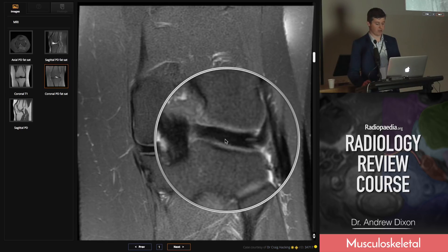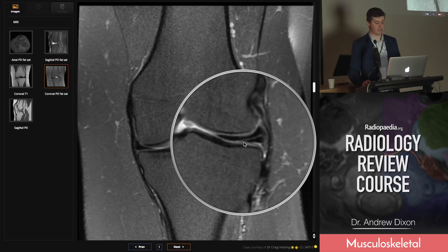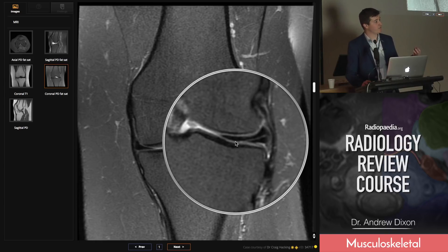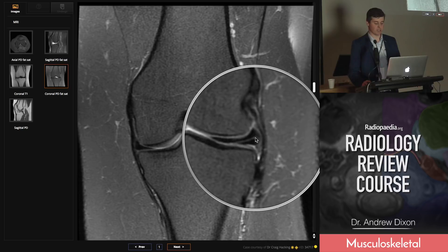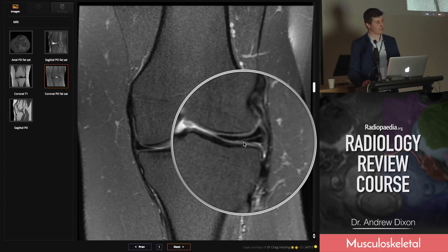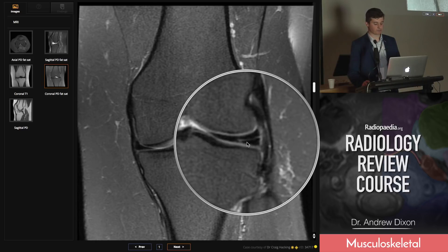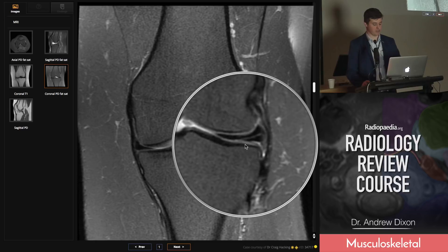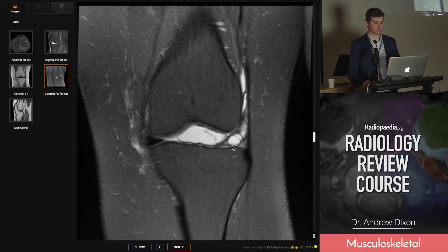This patient looks like they've got a discoid lateral meniscus — the lateral meniscus would usually come in to about here, but this one goes in much further. A discoid lateral meniscus is much more likely to develop a tear. The horizontal tear extends from the periphery to the inferior articular surface, and it's present on well more than two slices, so we're happy to call that a horizontal tear extending to the inferior articular surface.